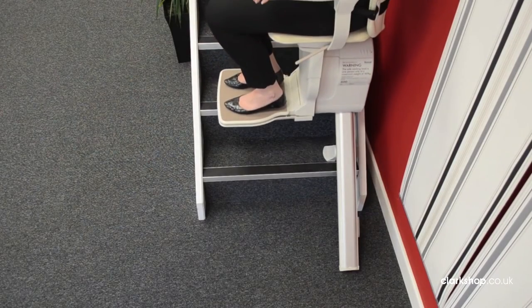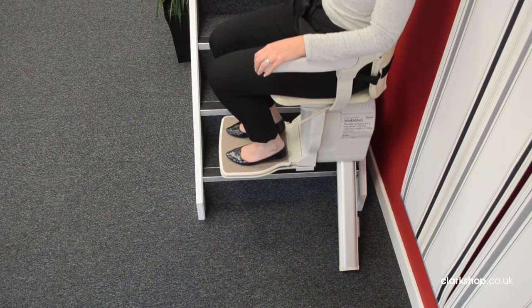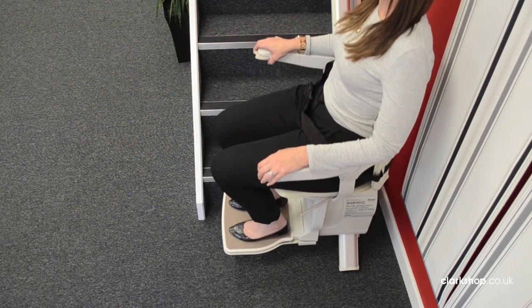Press the button to set the stairlift in motion. Keep your finger on this button the whole distance of the stairs. If you take your finger off this button the lift will stop.